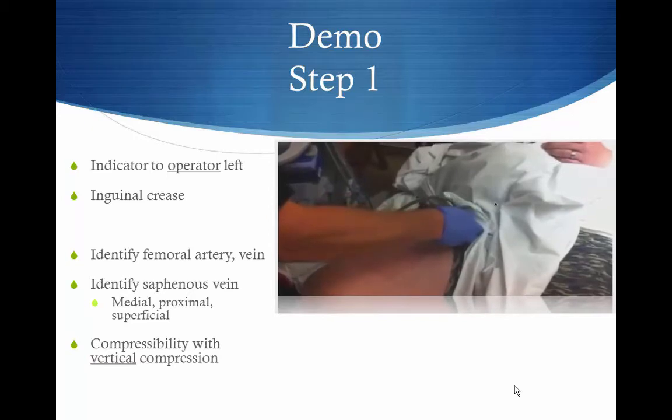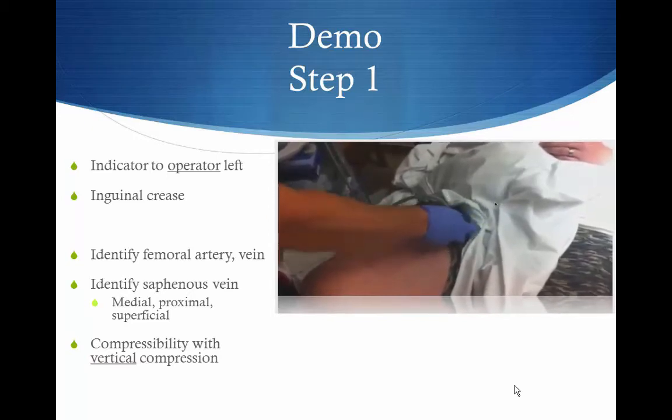And you can see you're right in the groin. This is a familiar spot for the patient. Helps to have hairy arms.